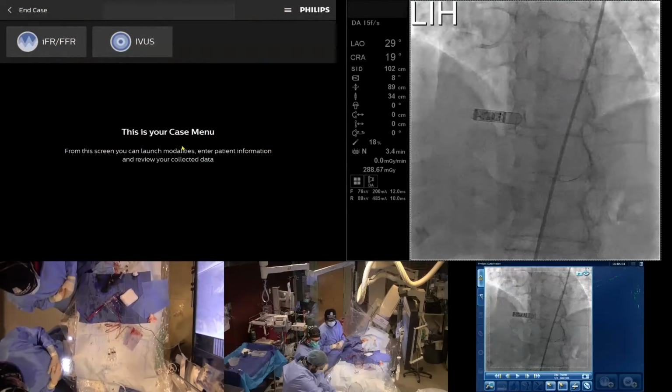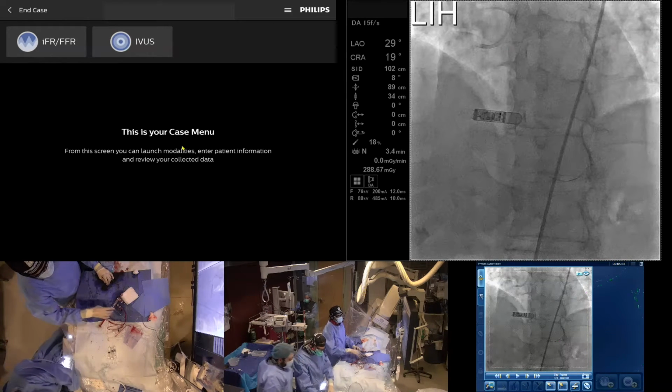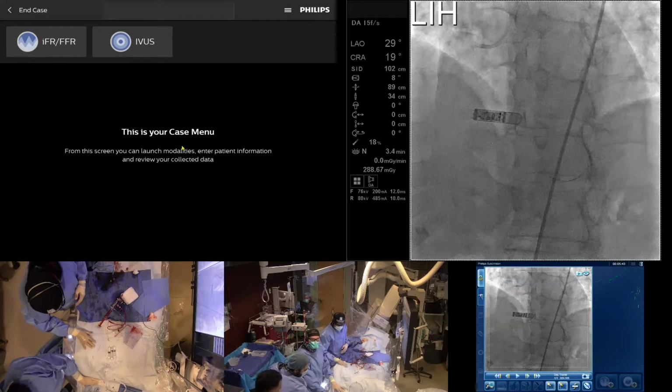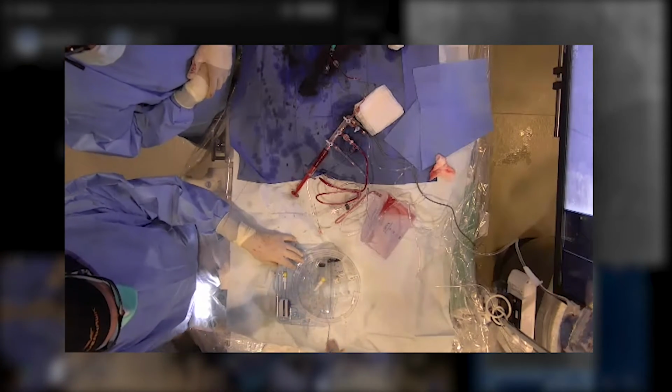First, number one, always flush, right? Done. Okay. Number two, we open this thing here. Let's bring it up here. Okay. Perfect. Now, number two, open up and connect just like with the old wire.